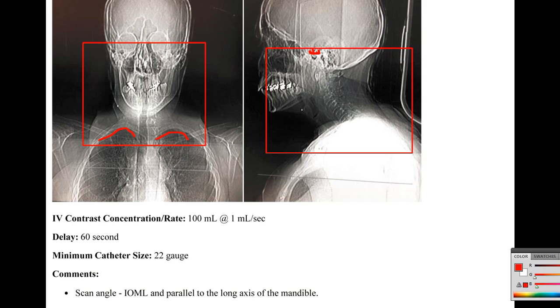Also, I want to say that if a patient has an unknown mass on their neck that has steadily enlarged itself, it would not be a bad idea to utilize BBs. I'm sure we've each seen the BB markers, and basically what you can do is put it on the superior and inferior portion of this enlargement, and that way it will give the radiologist a heads up on where this mass is, so that they can get a more precise location.